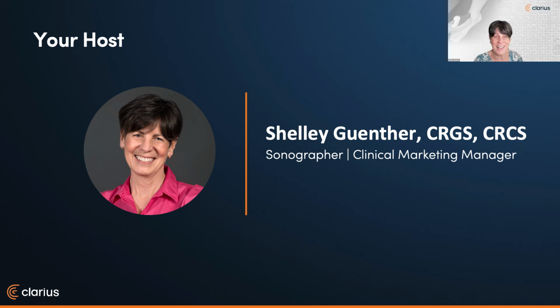Now, neither Janae or I have had much experience in scanning the foot, so working on this webinar has been a real valuable learning experience. Now, before we get on with the presentation, I'd like to review some literature I came across when putting together the abstract for this webinar.